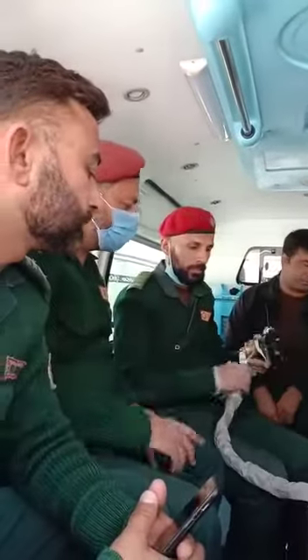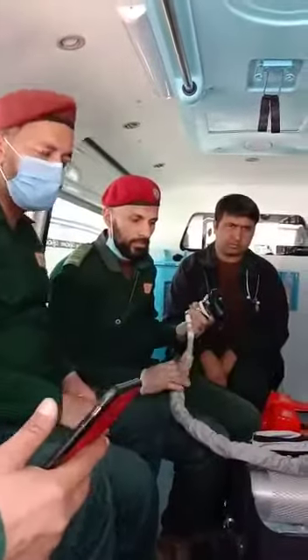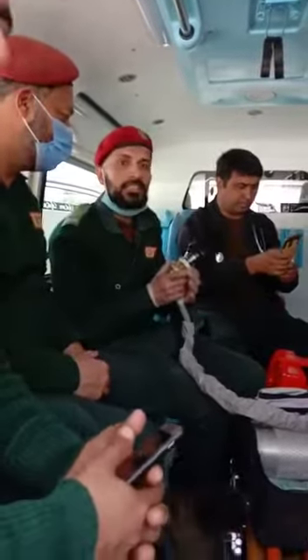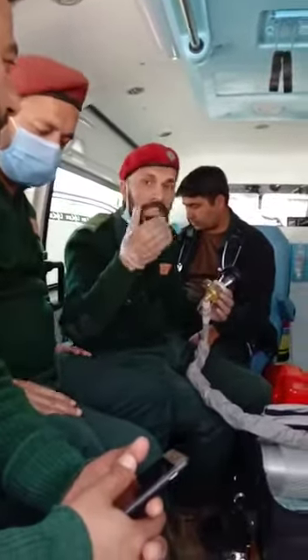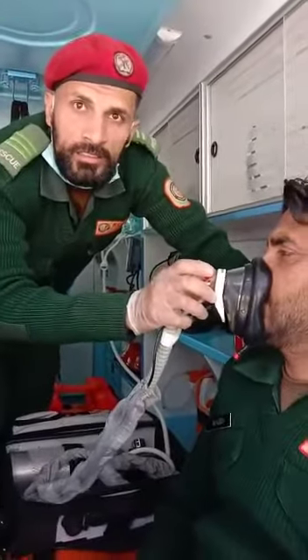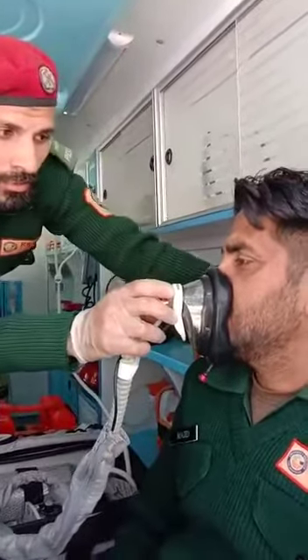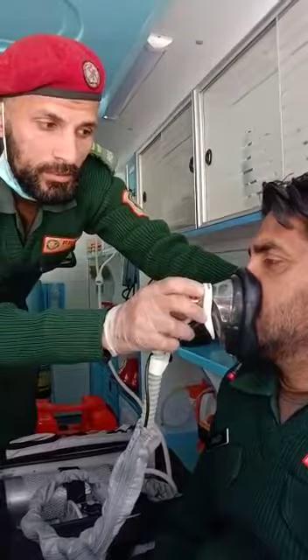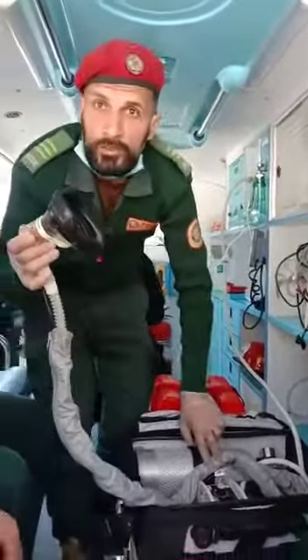Now let's look at demand flow. What is demand flow? The demand flow means that whatever position the person is in, it will provide oxygen according to their demand. Watch — he is getting the oxygen according to his demand. The demand flow is the flow of oxygen that adjusts to whatever the patient's breathing demand is.